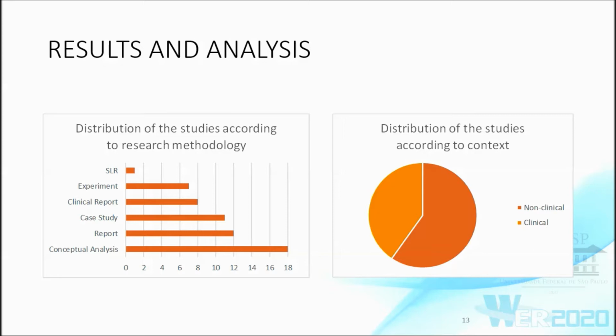Clinical report that details an experiment in a clinical setting without declaring research questions. Experiment that reports an experiment with clear goals, not necessarily in a clinical setting. Conceptual analysis that discusses a theoretical concept or novel approach without validating it. A report that conducts a discussion on the analysis of the past and the state-of-the-art technology. And systematic literature review that conducts a systematic literature review.